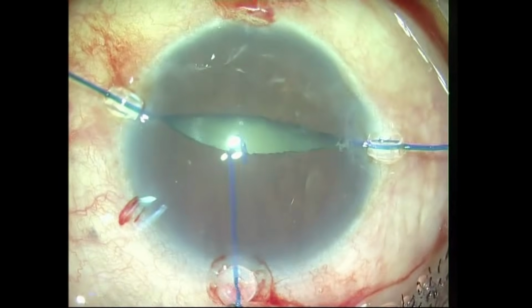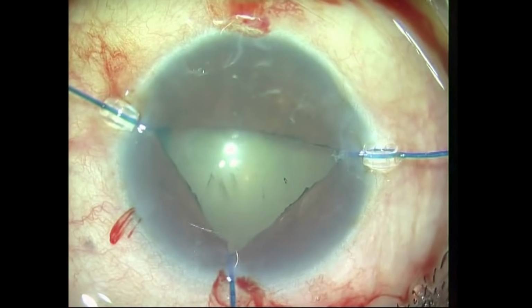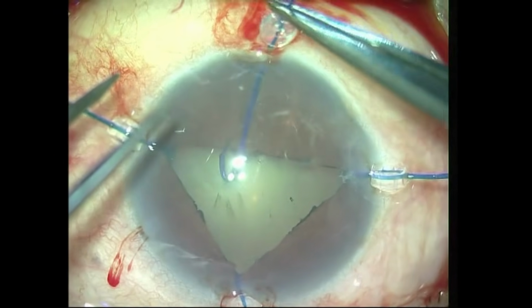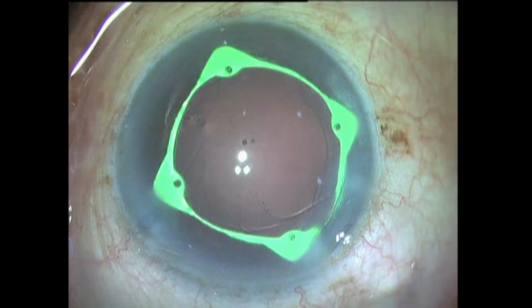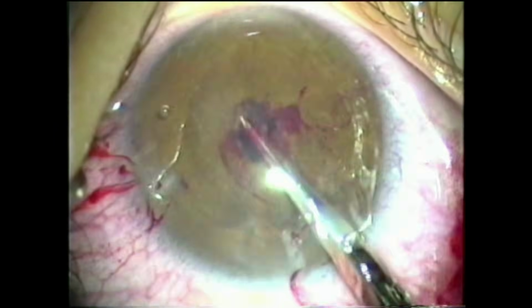The advantages of this technique include the ease of manipulation and availability of the hooks in different sizes, materials, and design. In addition to iris hooks, we have other popular pupil expansion devices such as the Malyugin ring, the Graether ring, the B-Hex pupil expander. Minimal bleeding can occur with all of these techniques, but it usually settles on its own.